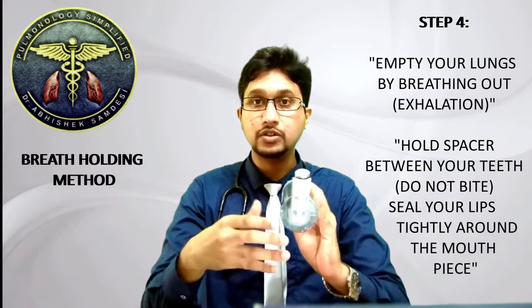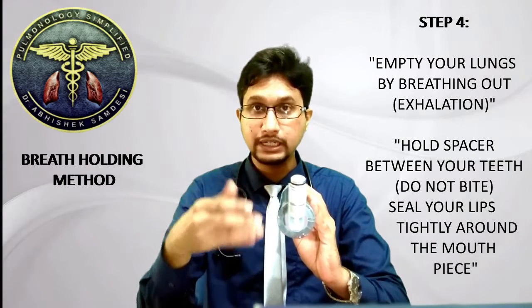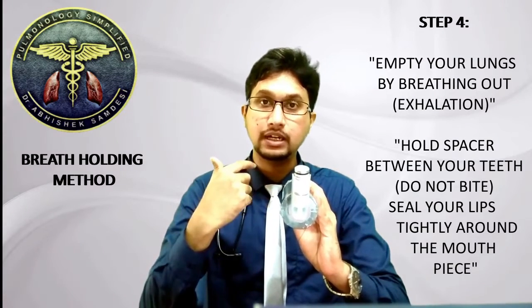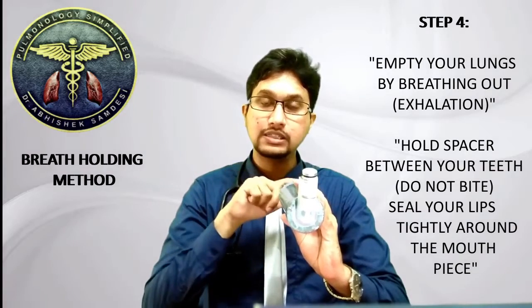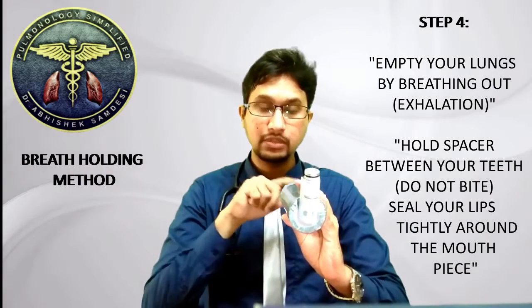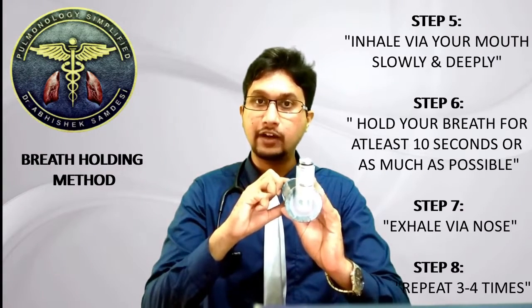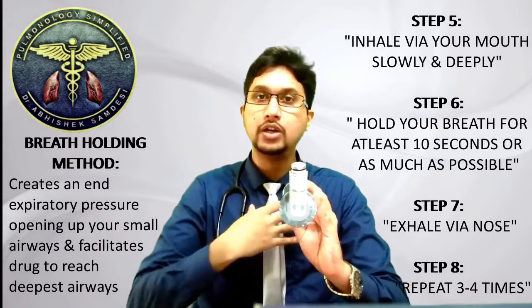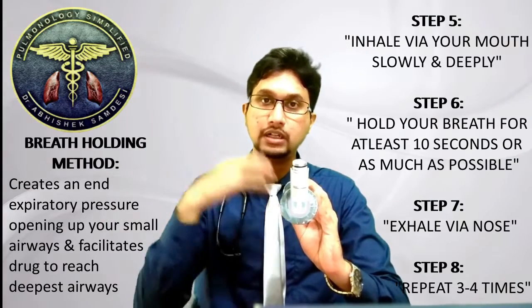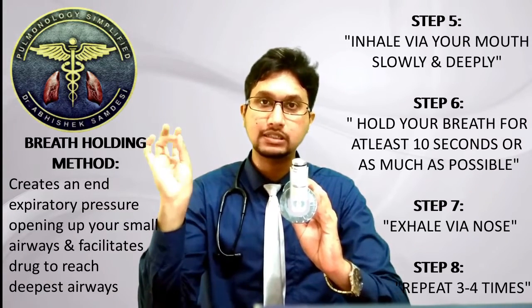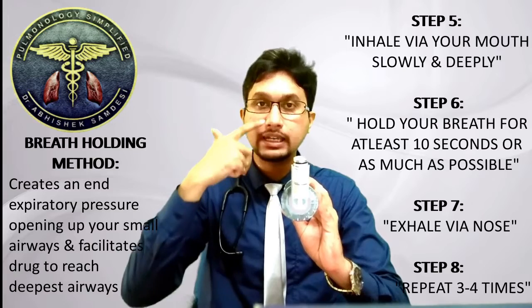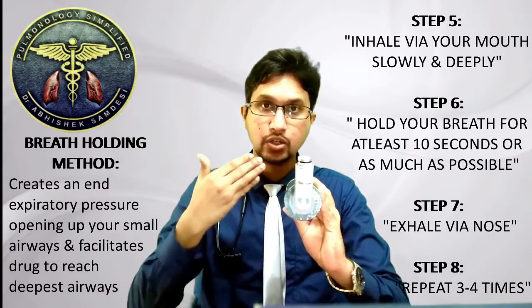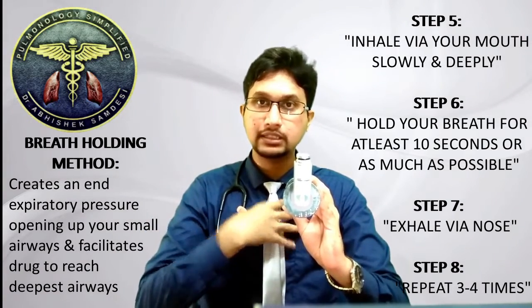The next step is to exhale completely, then hold the spacer in your mouth and seal your lips firmly around the mouthpiece. After that, take a deep inhalation and hold the breath, counting for at least 10 seconds, and then exhale via your nose. Inhale via your mouth, hold the breath, count 10 seconds, and exhale via your nose.